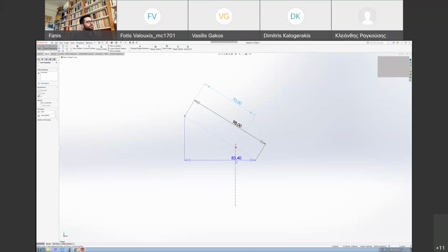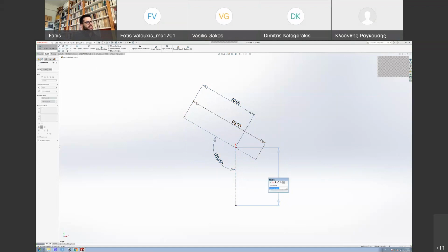This is also a very important angle that you have to take from your 3D model, okay? And now for me, it's something like 120 degrees. Make sure you're working with degrees and millimeters also. Okay, now I'm gonna specify this length to be 120. That's a bit arbitrary. It's not extracted from the 3D model in any way.